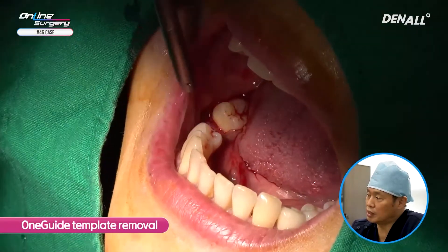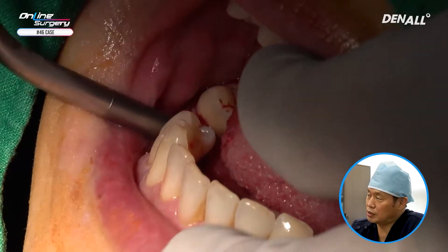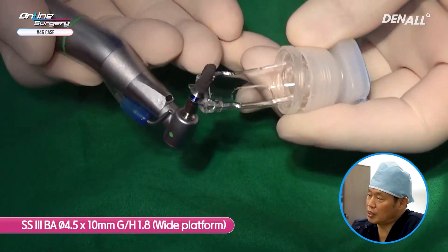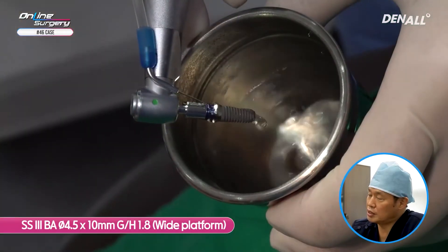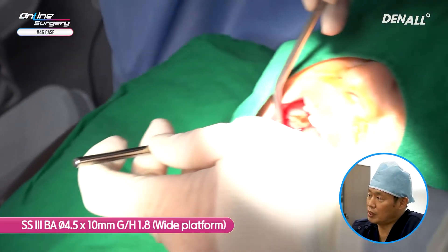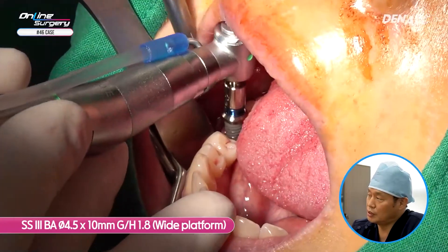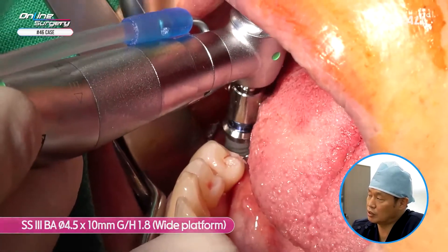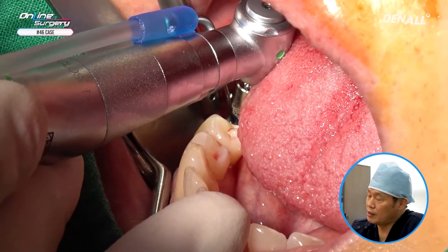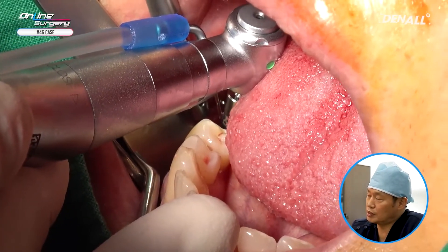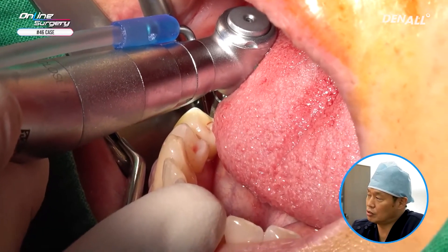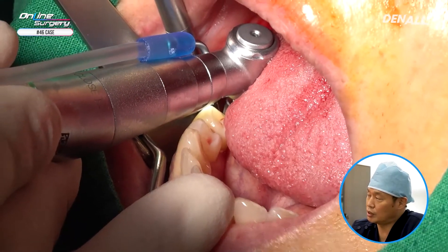Drilling is complete and the template is removed. SS3 BA diameter 4.5 by 10 mm wide implant is placed. The gingival height is 1.8 mm. This is a wide platform being placed into the preformed drill hole. The implant is being placed without the template, and if it goes in passively, it will go into the drill hole that was formed.